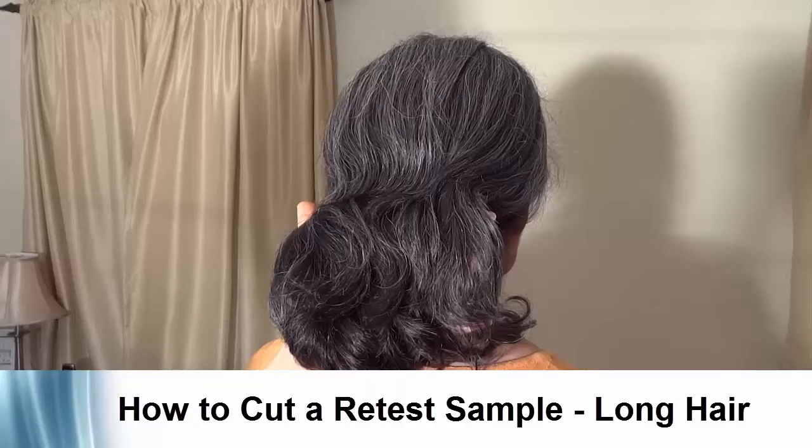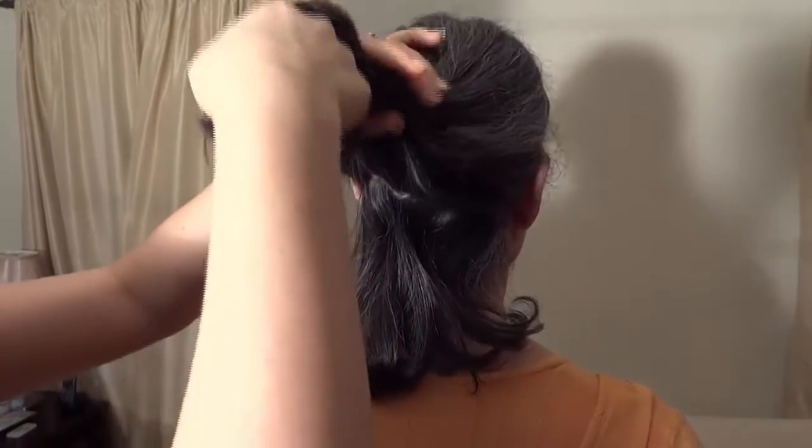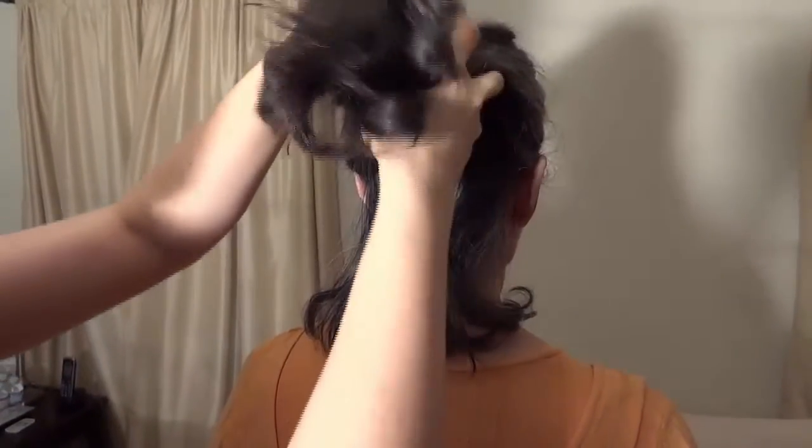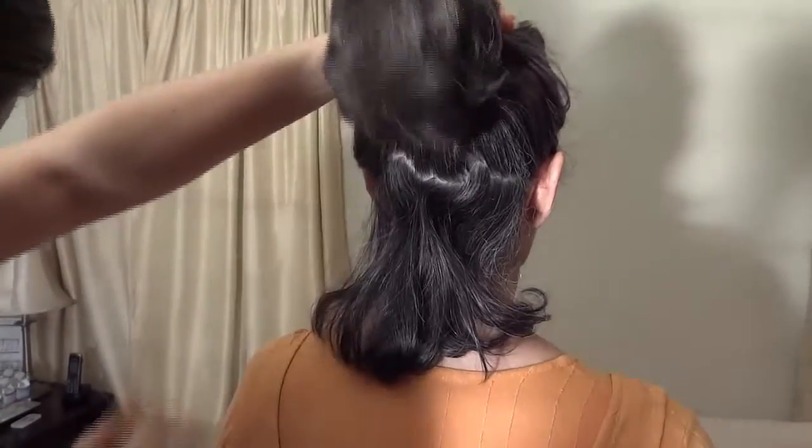How to cut a retest sample on long hair. We're going to cut a retest hair sample from Deborah here. She has done a hair test with us before, so we are now looking to find the spots we cut from last time. There will be new growth of hair there that we can use.